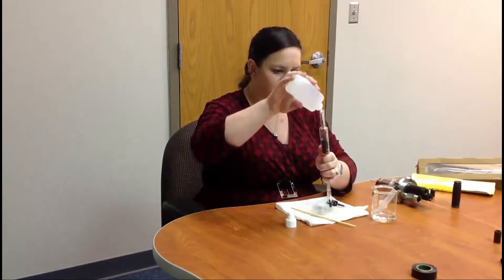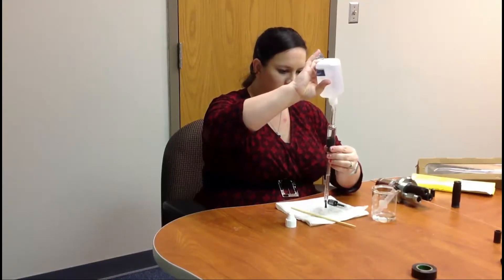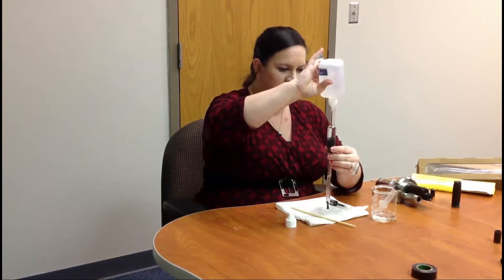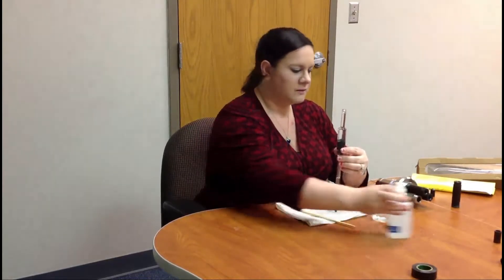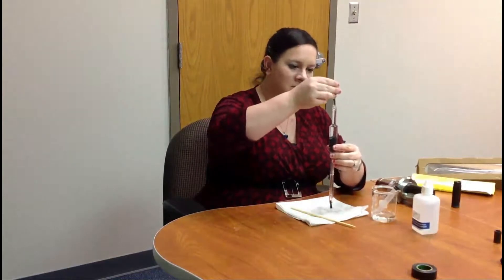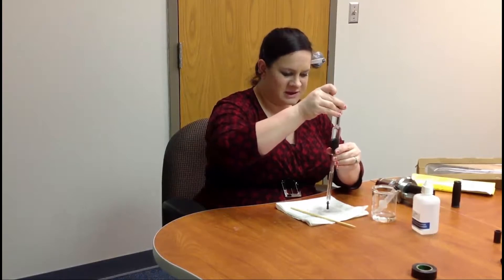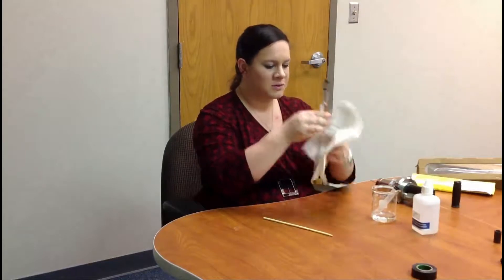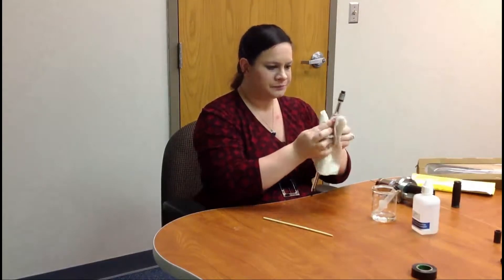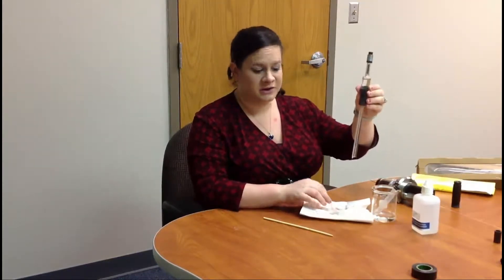Then refill the sensor with KCL solution — fill it all the way to the top. Depending on how full you get it, some KCL solution may slip out once you put the cover back on. Just put the reference element back on. Air bubbles will work their way out. Wipe it off, unplug, reinstall, and you're good to go.